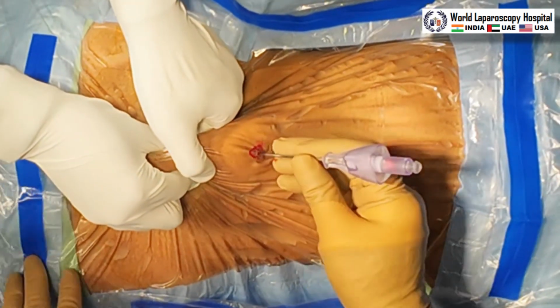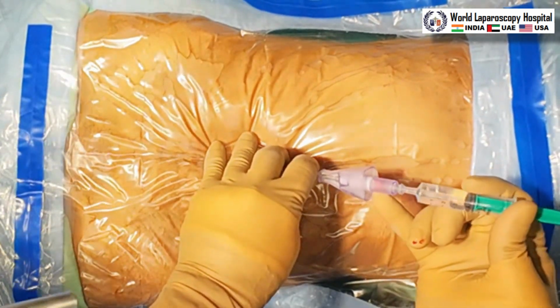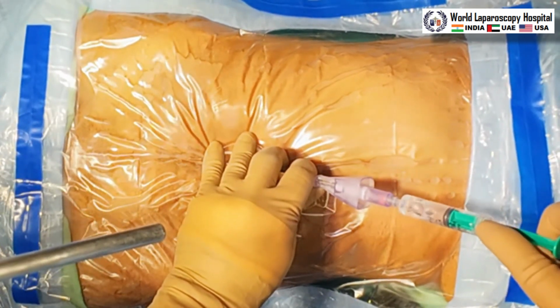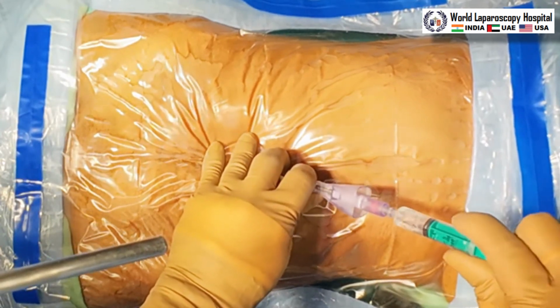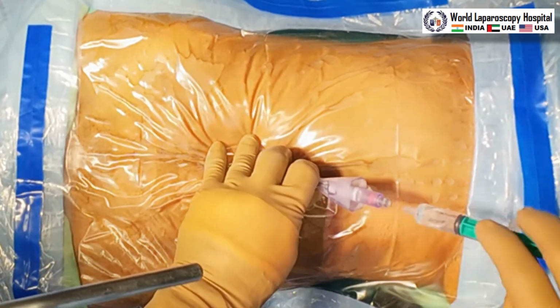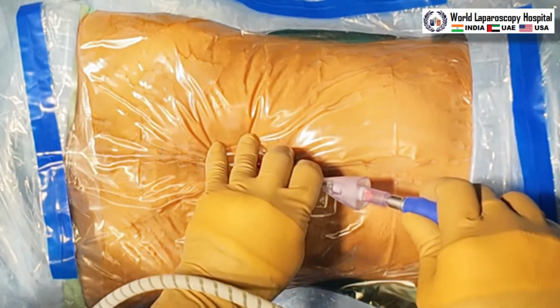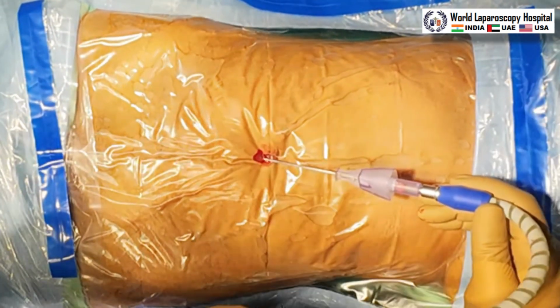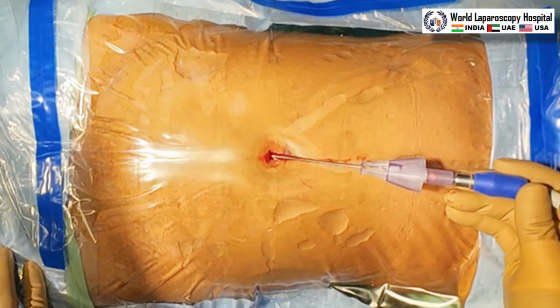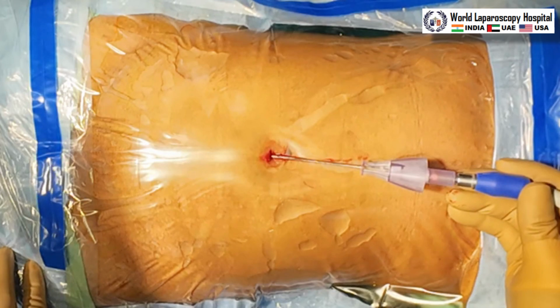and these are the 2 clicks and we are inside the abdomen. After that, just as usual, irrigation test, suction test and hanging drop test. We can see this ball is floating in the disposable Veress needle and now this ball will sink. So, that means we are inside the abdomen and now insufflation is started. We can see slowly 1 liter per minute gas is introduced and pneumoperitoneum is completed.